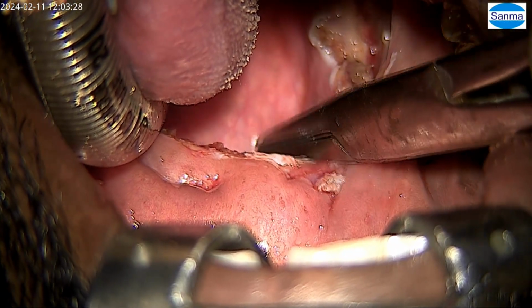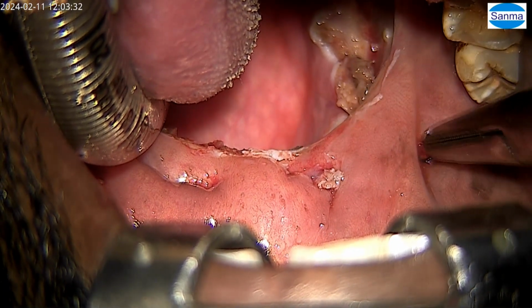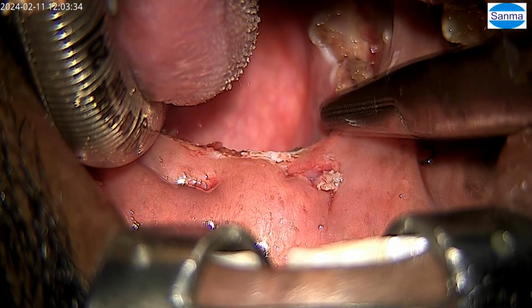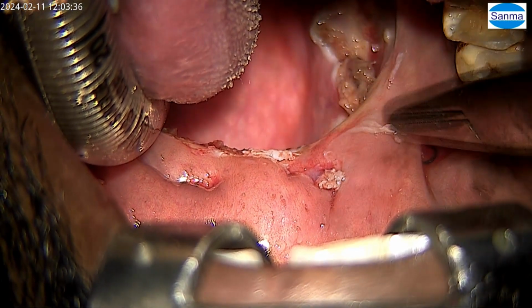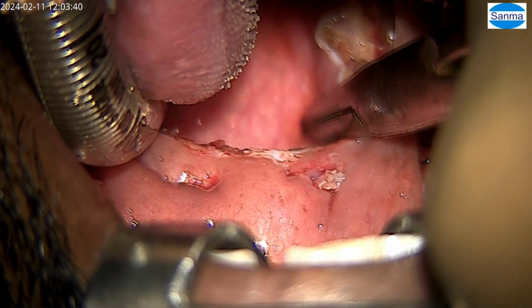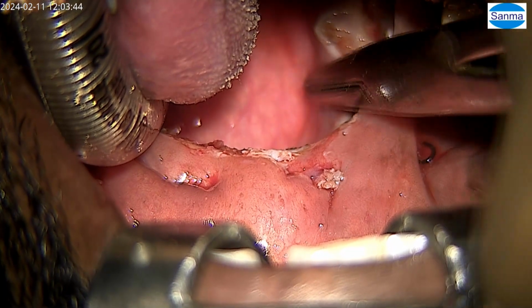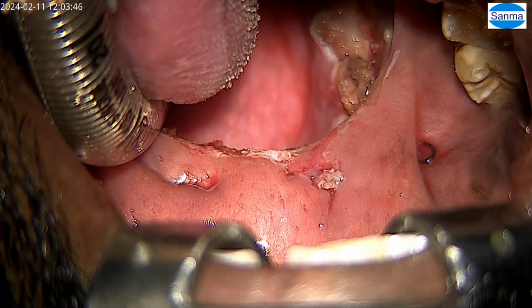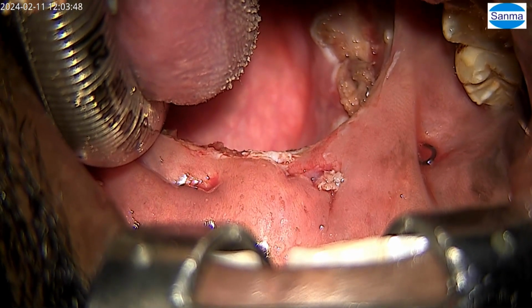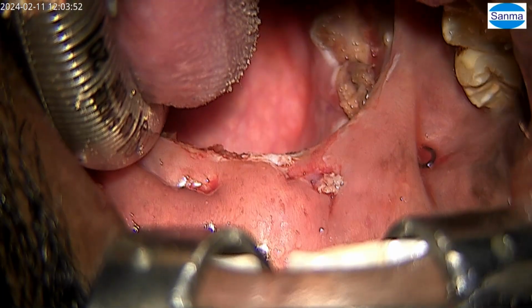Now we do not have any solution for the posterior pharyngeal wall collapse. I have done one case with a non-absorbable suture. I have gone from here, taken it and come back and gone to the other side. So I have also taken care of the posterior pharyngeal wall collapse and the hypopharyngeal collapse here. I will not talk about it, because I have only done one case so far. Let me see the long-term results. But barbed suture, non-absorbable, is the key.